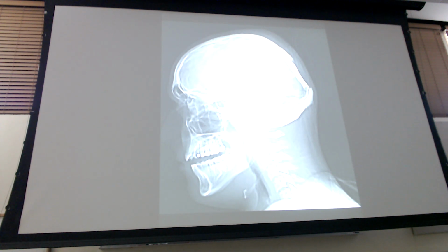So, depression fracture, not to be confused with compression fracture.